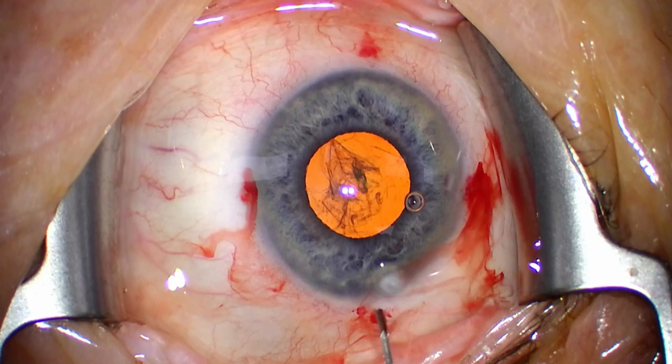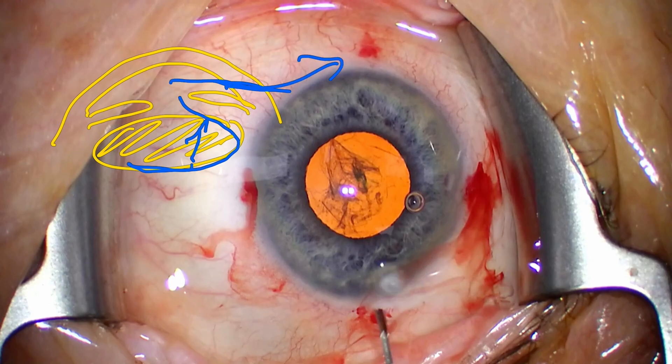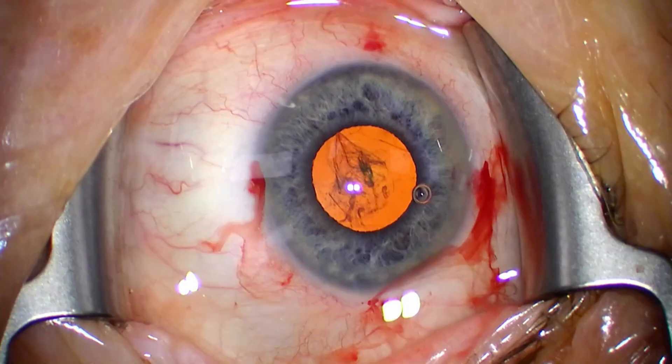In these floppy iris cases, you need to take care about iris prolapse — you can basically expect it to happen if you're not careful. One of the first steps it happens is hydrodissection. If you imagine the eye from the side, you have your lens, your iris, and then your cornea. Injecting water behind the lens pushes the lens forward, and pressing on the wound releases viscoelastic outside the eye. The pressure gradient is clearly in that direction, and that will take the iris out of the eye and make it prolapse. Here we can see that happening.